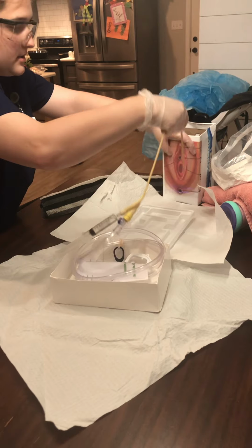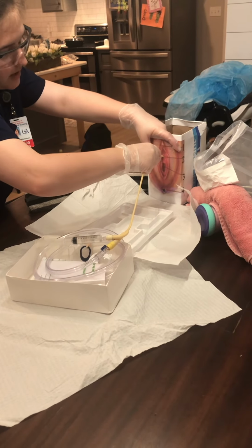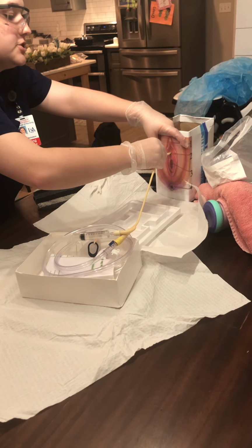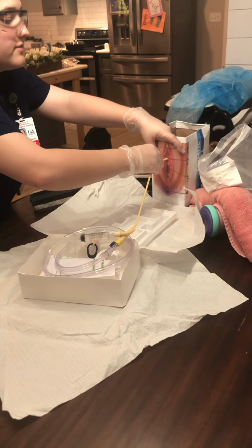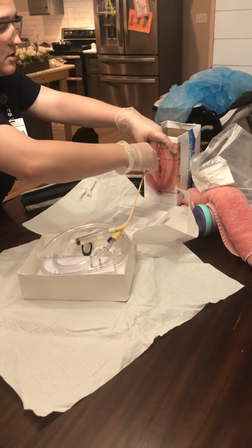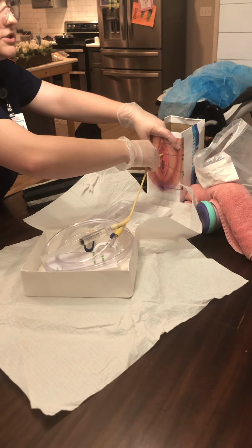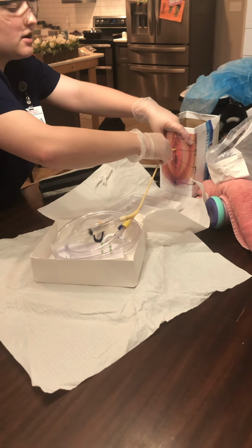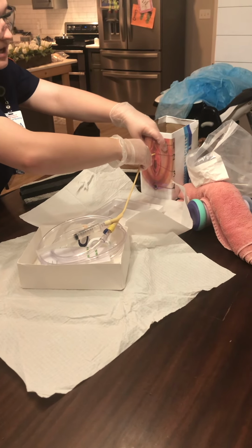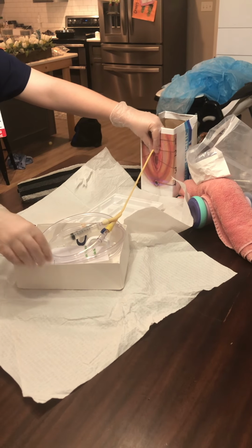Okay, so I'm going to slowly go in. I'll lubricate 1 to 2 inches for a female, 5 to 7 for a male, and I'm going to insert until I get urine. For a female, I would insert 1 to 2 more inches, and for a male, I would go all the way to the bifurcation. So after I insert more, now I'm going to hold it right there.